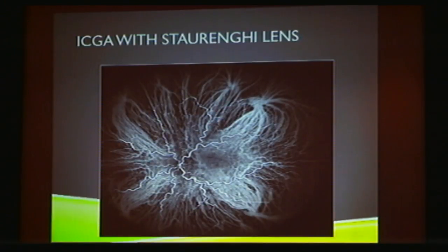So no wonder that in the 90s, when ICG angiography got a resurgence with the advent of digital angiography systems with the work of Hayashi and Yannuzzi, everybody thought that we're going to solve many mysteries of retinochoroidal diseases. We're going to have new inputs into the way we understand and treat these diseases.